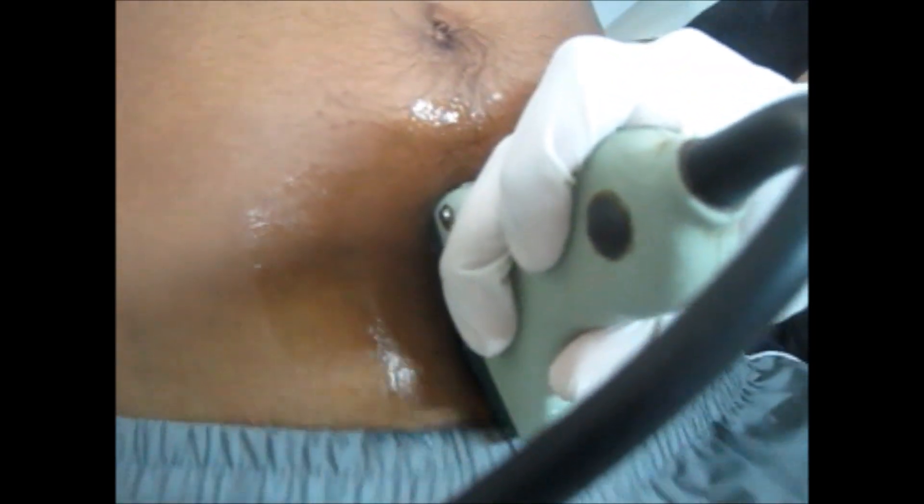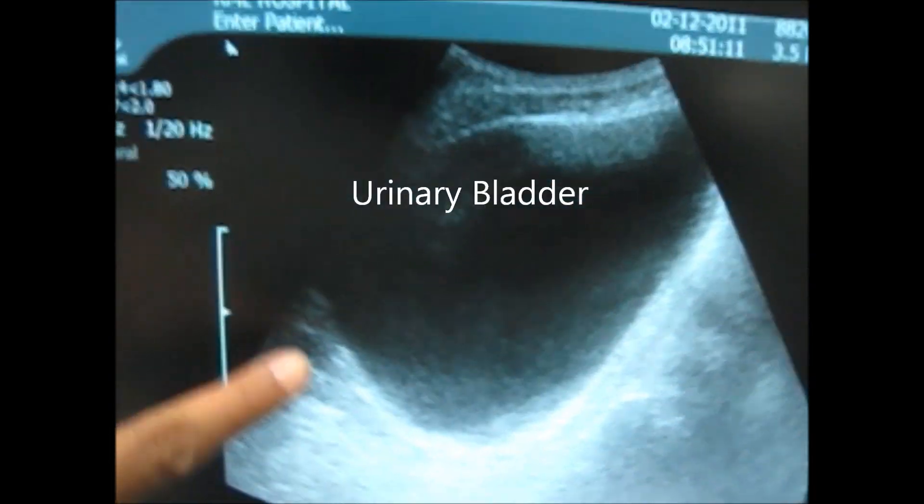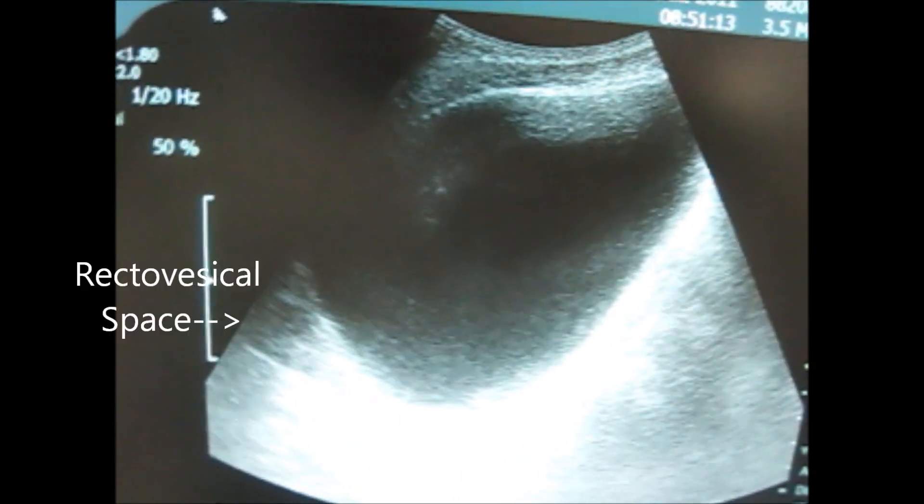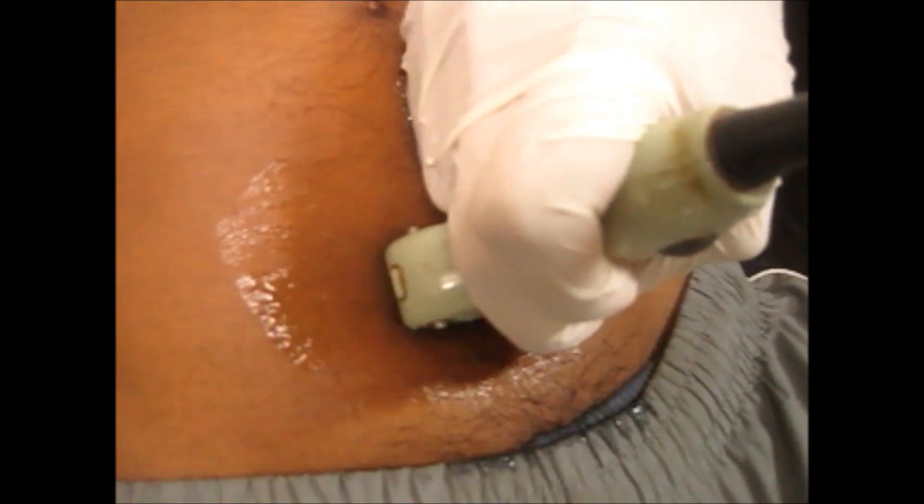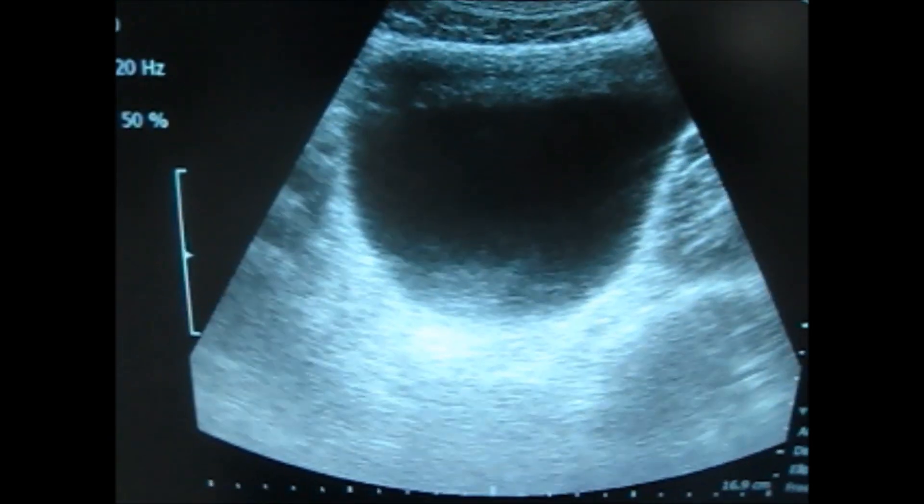Now coming to the pelvic view — first of all, put the probe longitudinally above the pubic symphysis. In females you will see the bladder and uterus, while in males you will see the bladder and the rectovesical space.